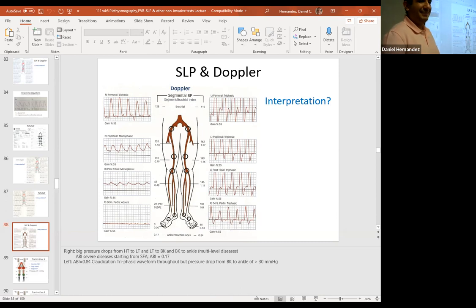Just curious, what would be the verbiage? I'm pretty sure you have to say that to someone, right? In terms of not letting them leave, because you found a weird finding, or even a blood clot. Yeah, so I just have to show all these to the physician. Hold tight for a second. Student scan on you. Don't let them leave.